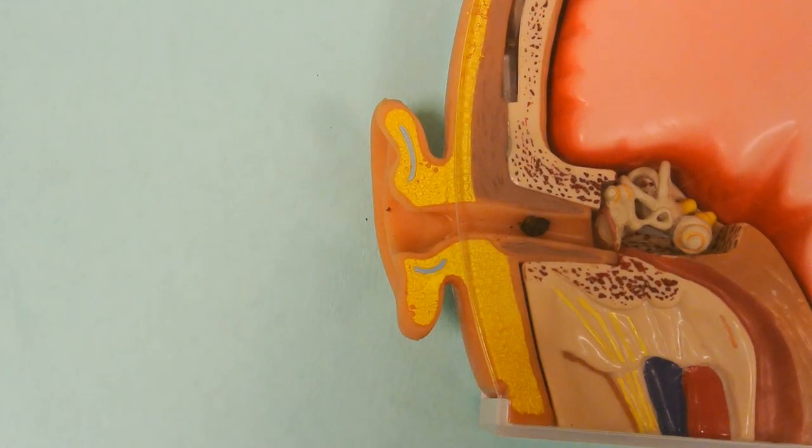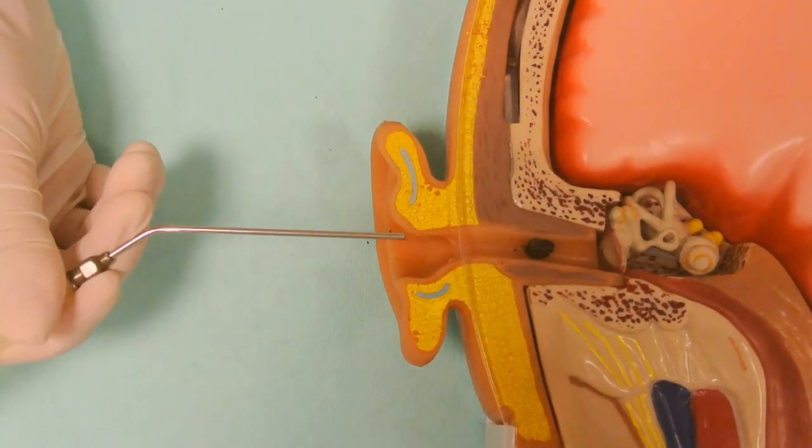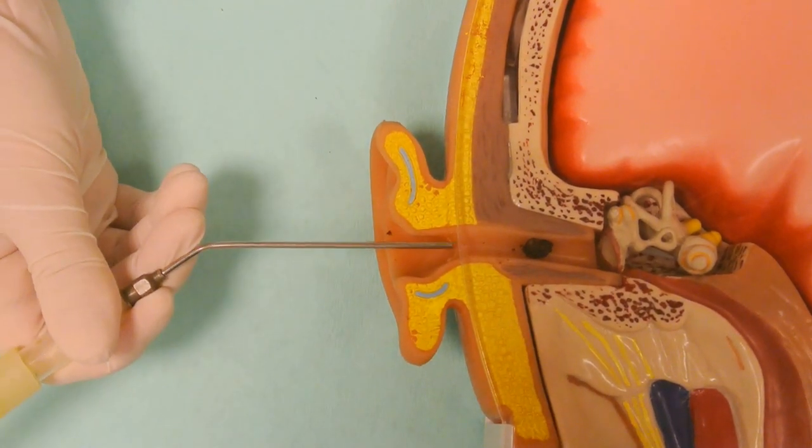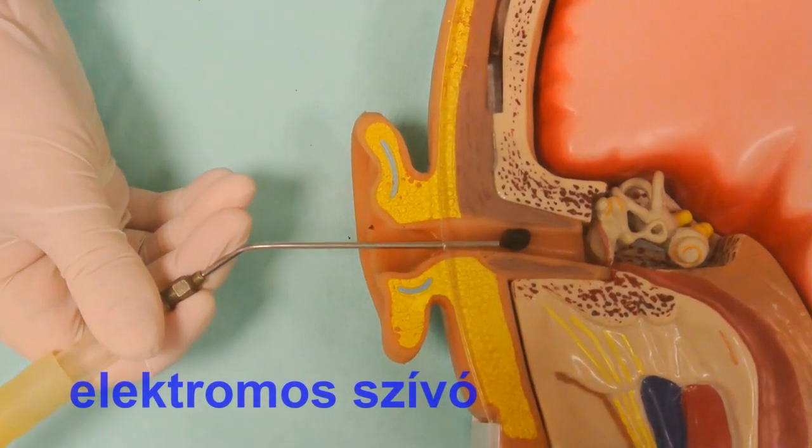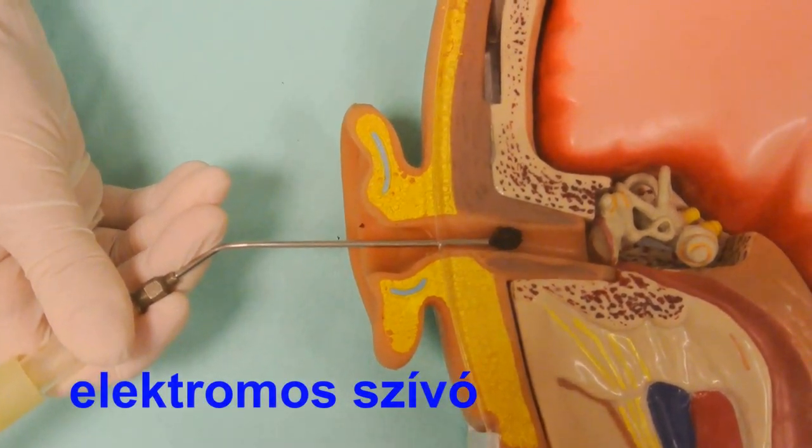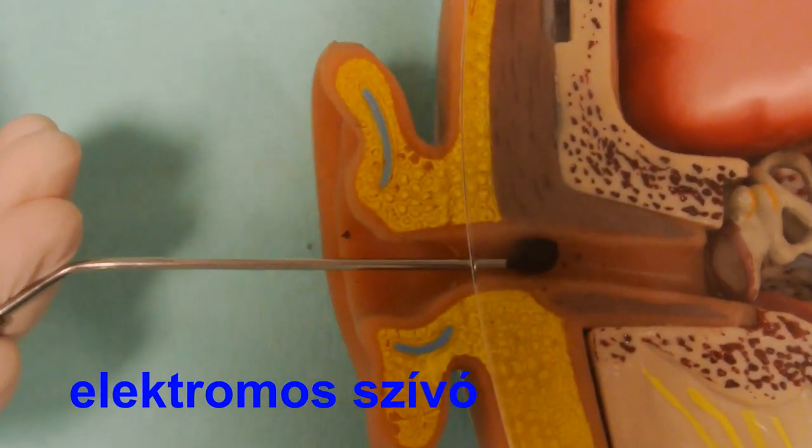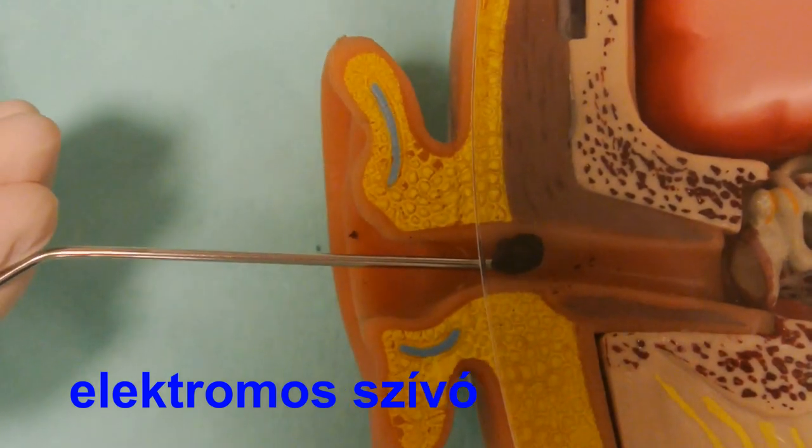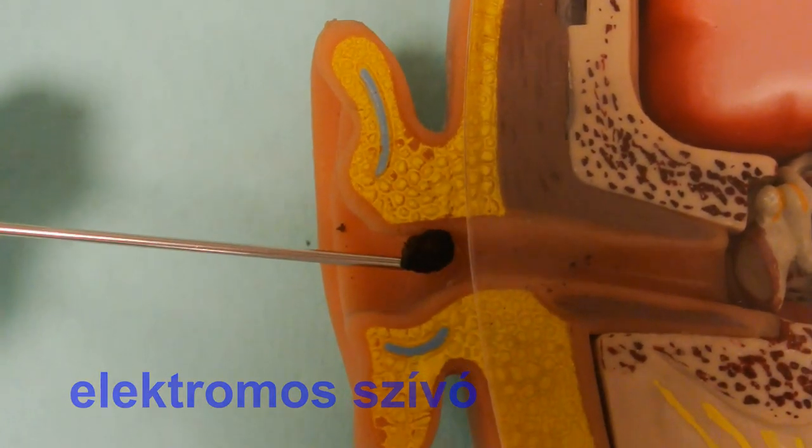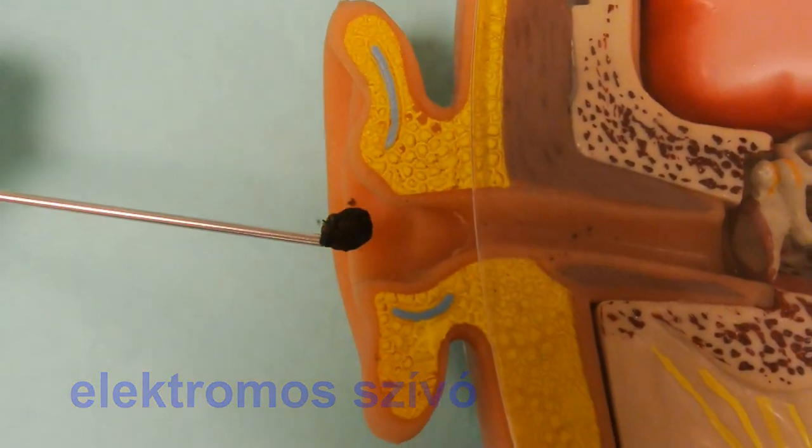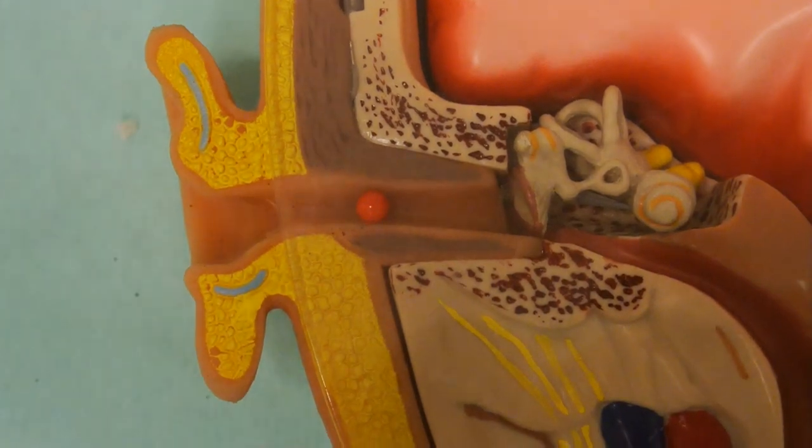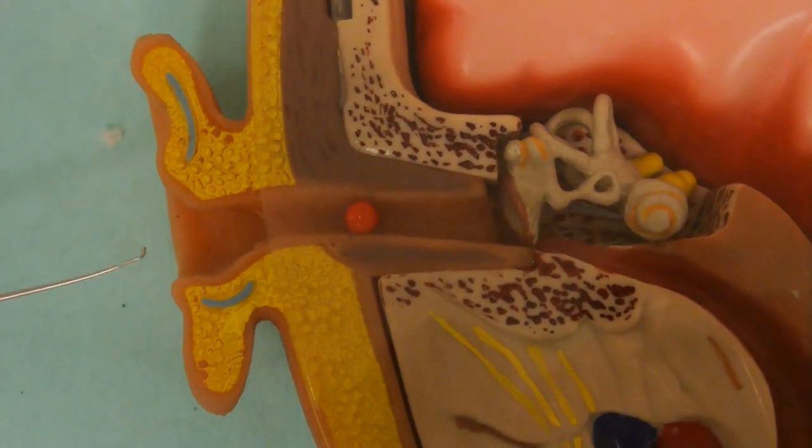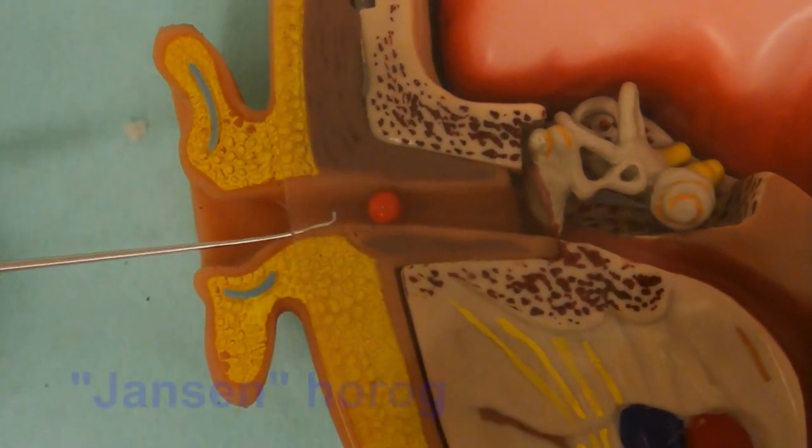Electric suction is also a useful tool to remove foreign bodies. We often use electric suction for removing objects, or a Jansen hook can also be used.